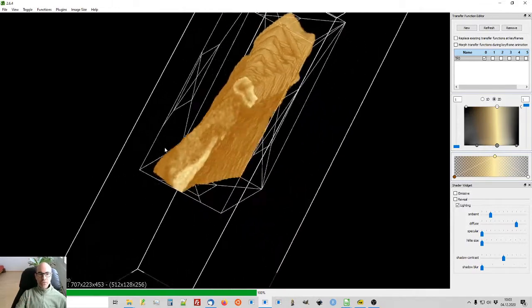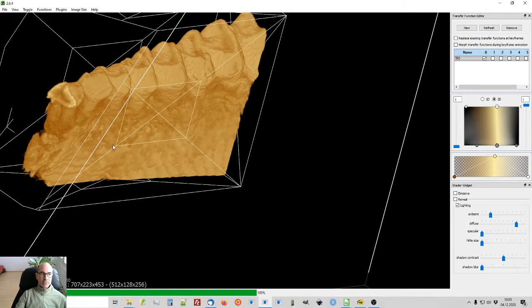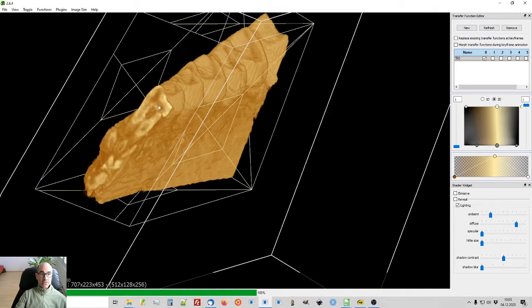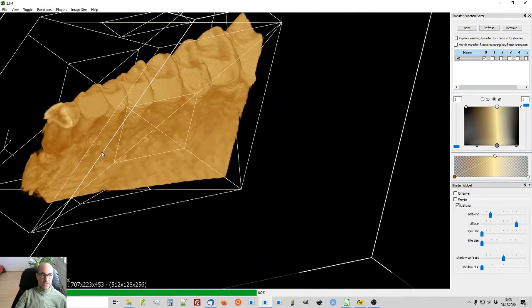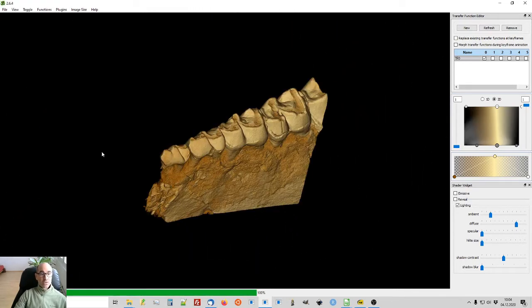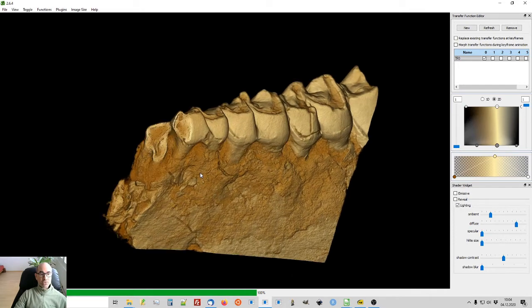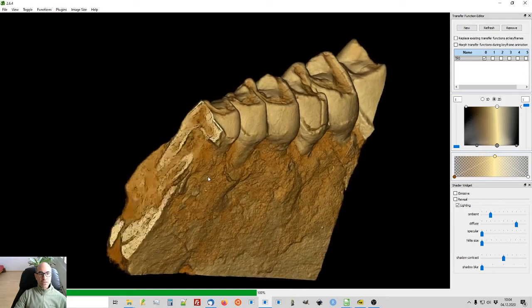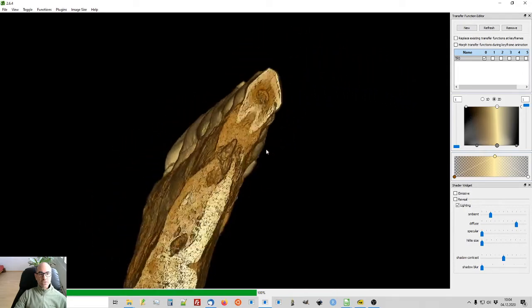it's moving beyond the plane of the reconstructed voxels, right? So that's the first premolar, and as I turn in low res mode, you can see that the image is losing some of the anatomy there as I turn it. And of course, the same thing happens in high res mode, so I'm going to press F2, and now I'm in high res mode. I'm going to zoom in a little bit, and you can see as I zoom in, a lot of that tooth is now disappearing in jaw, etc.